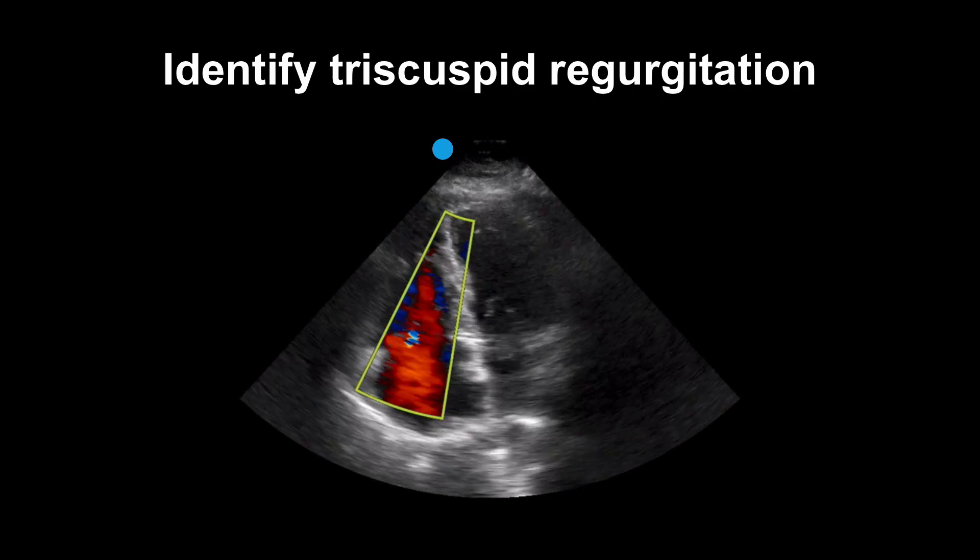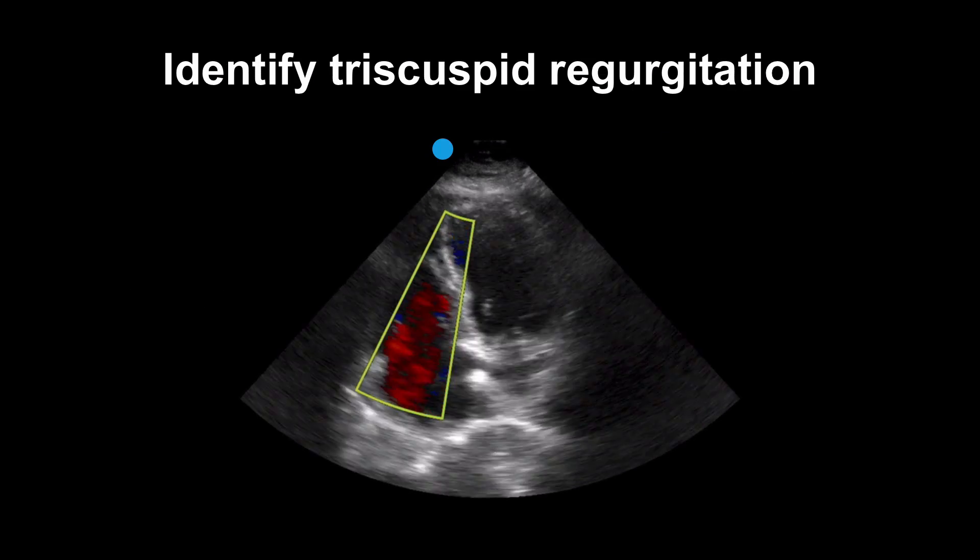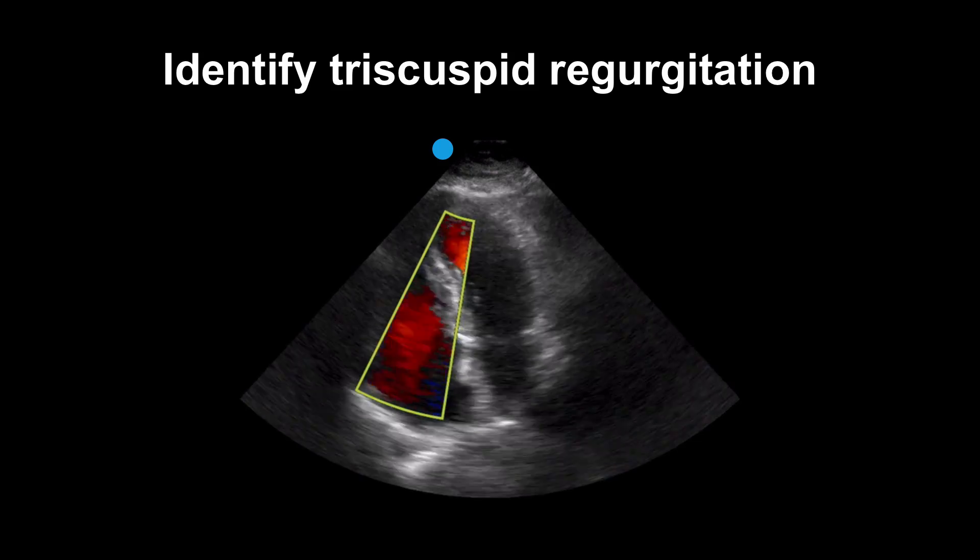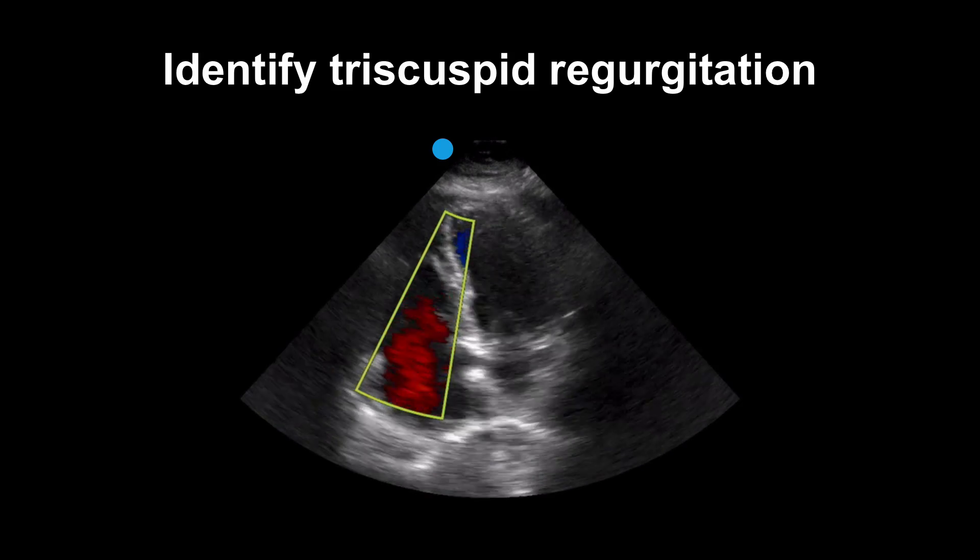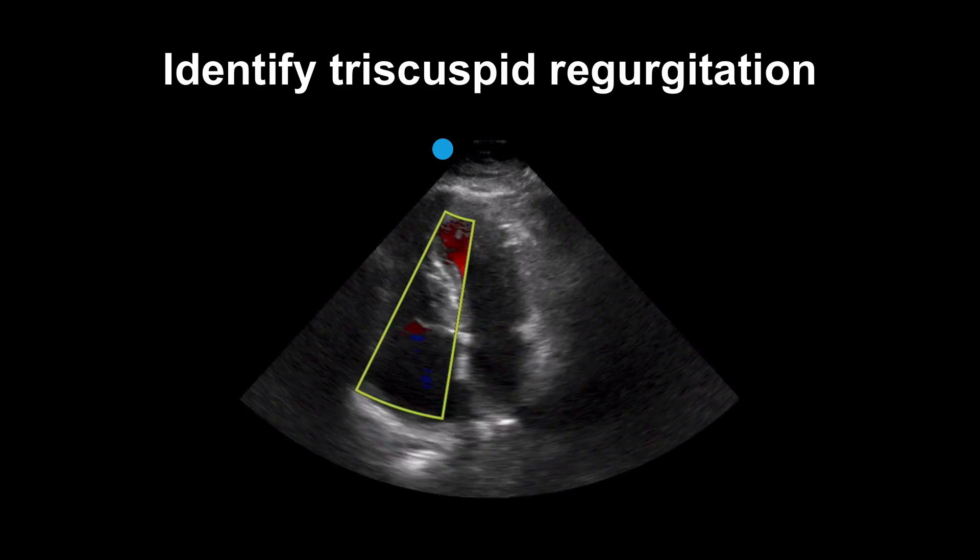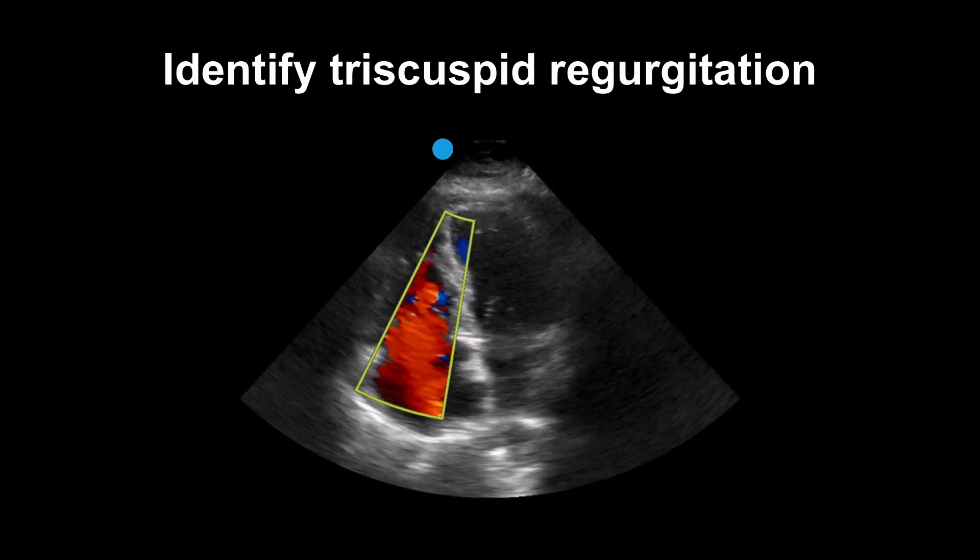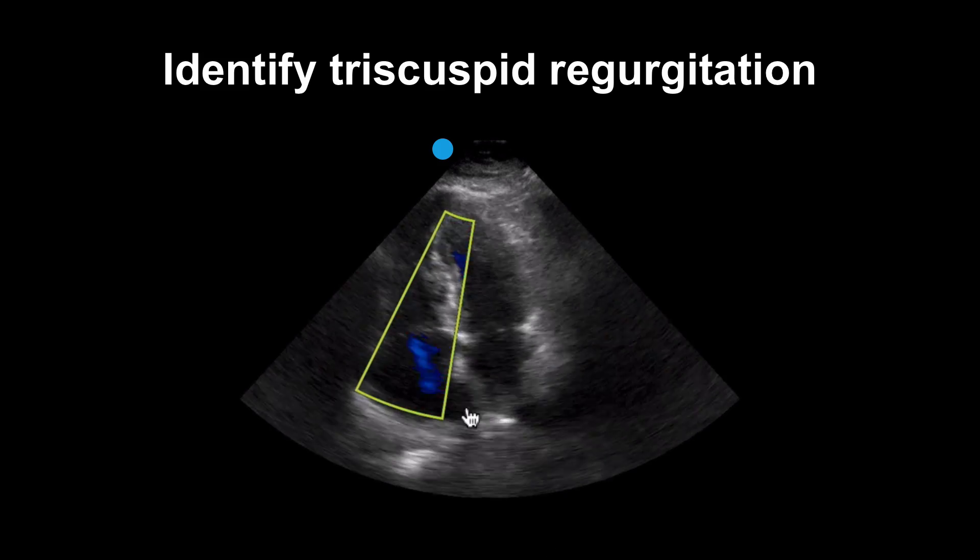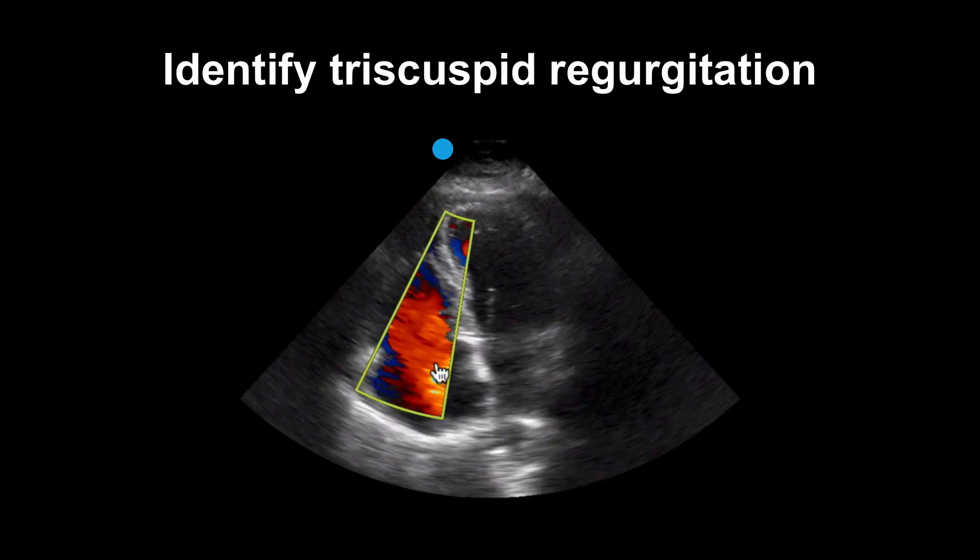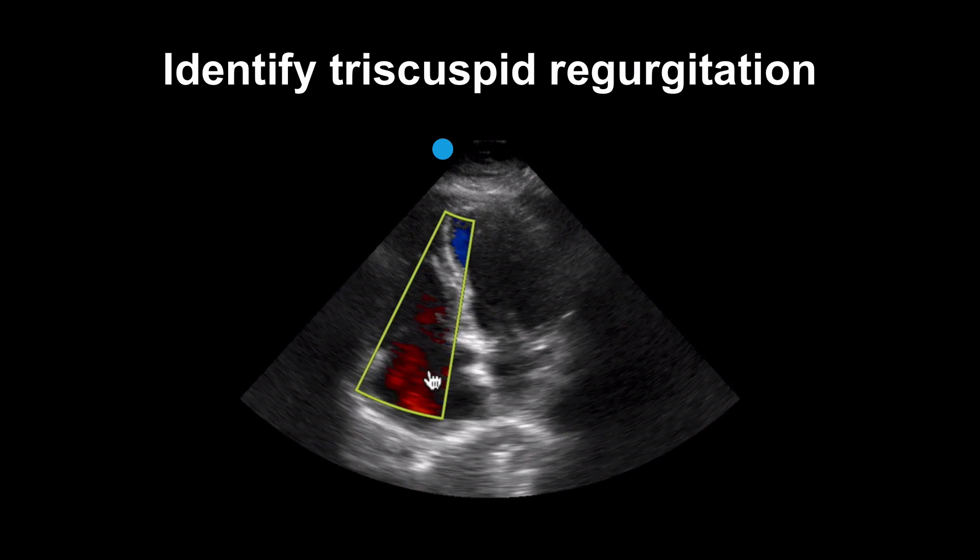Our first step is to be able to identify tricuspid regurgitation. To do this, we will activate a color Doppler box, seen here, and place it over the tricuspid valve in an apical four-chamber view. We'll identify a regurgitant jet using color Doppler. You can see the regurgitant jet here, the blue signal coming back into the right atrium.